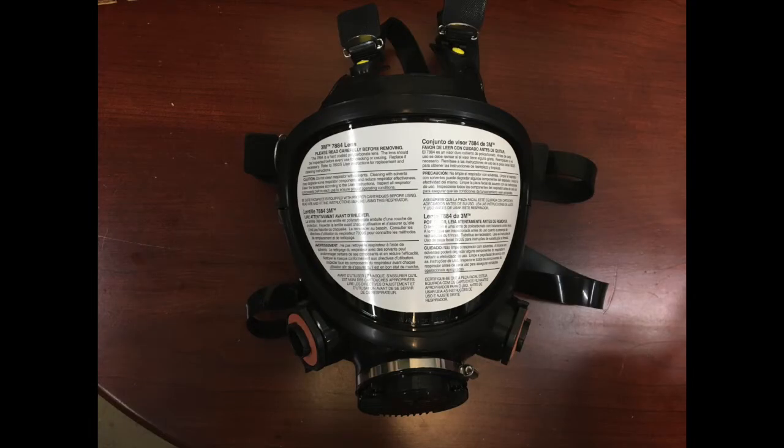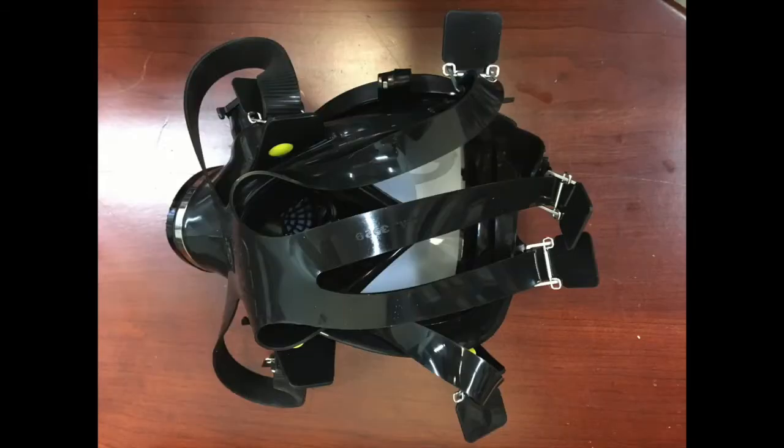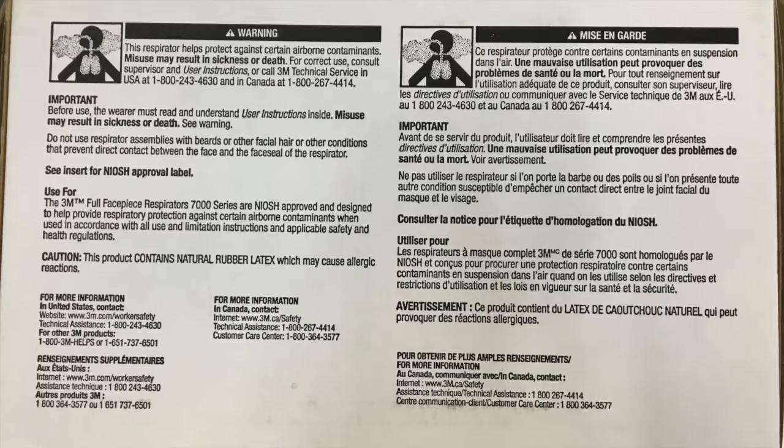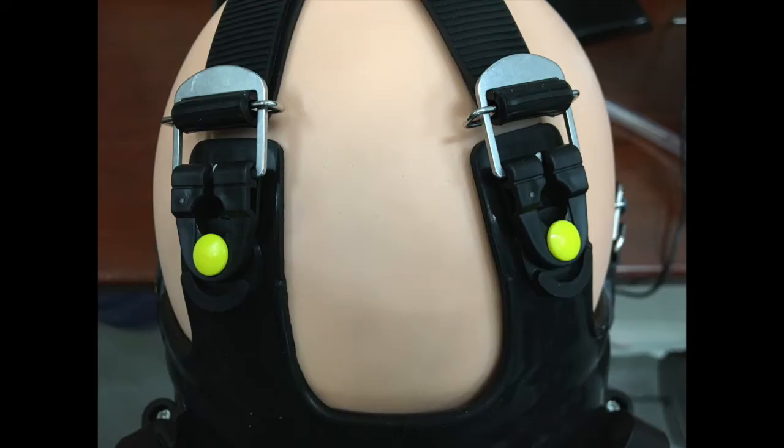It has a silicone seal and has six straps instead of the usual four straps that most of these full face mask respirators have. It has the typical 3M bayonet connectors for the filters, a voice diaphragm, and a direct connector for a PAPR. If you look at this photo, the straps can be adjusted and have a quick release allowing them to be disconnected during donning and doffing, but you don't have to lose the adjustment once you've got a nice fit.